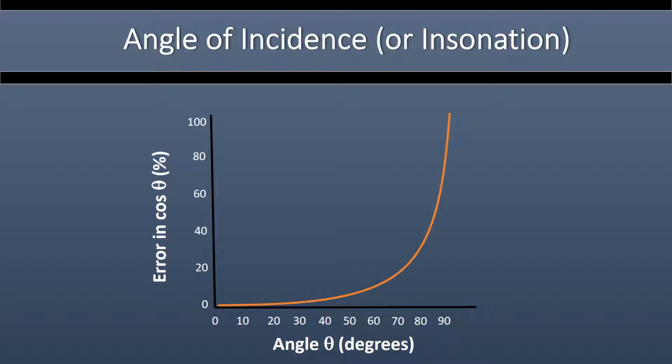When making velocity measurements from Doppler waveforms, the Doppler angle should be less than or equal to 60 degrees. At higher angles, the error in calculating the flow velocity just becomes unacceptably high. In general, the smallest Doppler angle is going to give you the most accurate measurements. So as close as you can get to 0 is going to give you the most accurate measurements. But anything 60 and below is considered acceptable with traditional Doppler measurements.